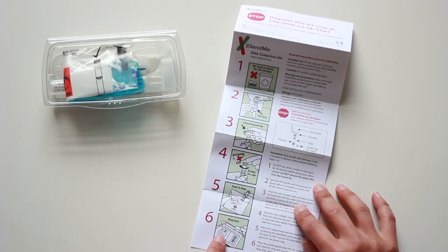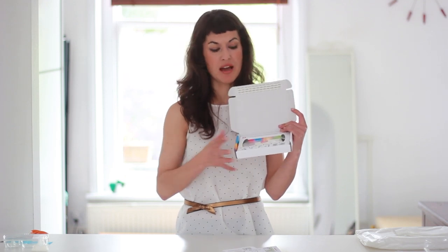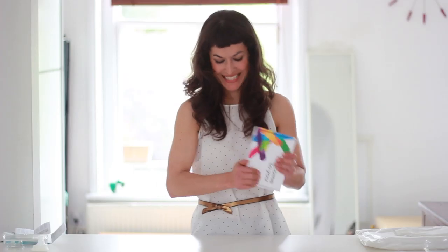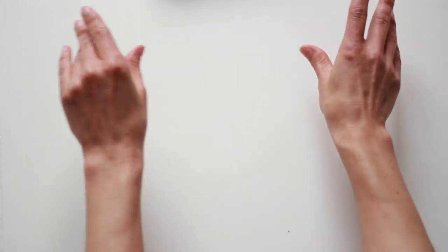Step number six: put it back into the box. Just like that — peel it and seal it. Properly sealed. Then we wait about three weeks. The address is already there in the box, the post is prepaid — you don't have to worry about anything. You're just ready to go.